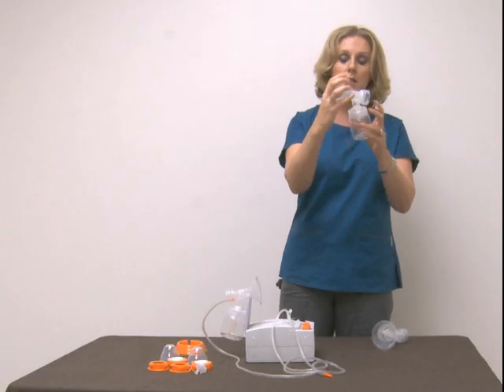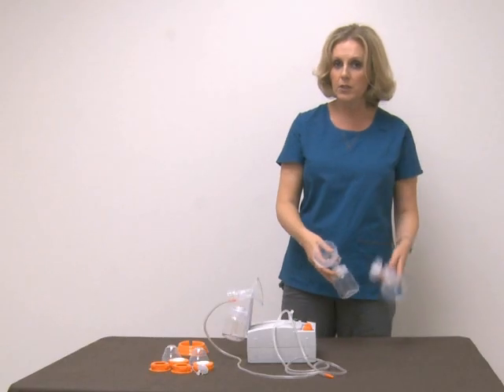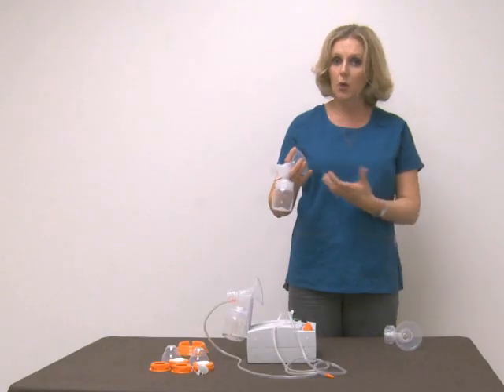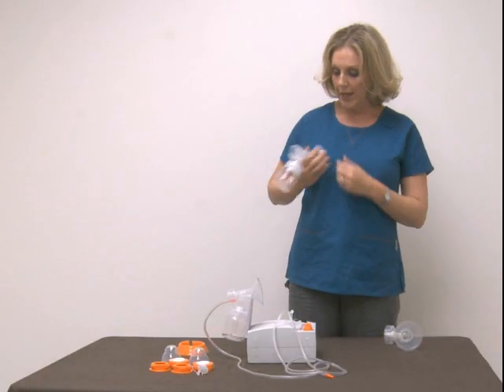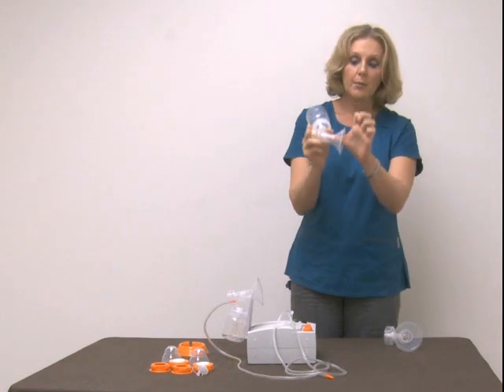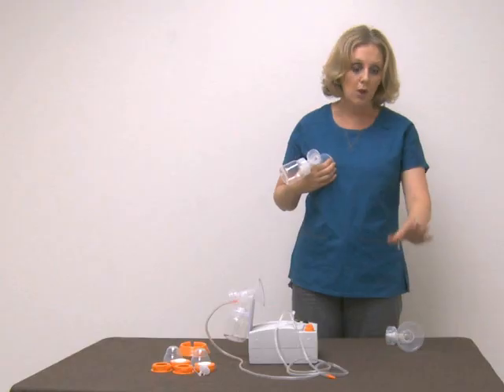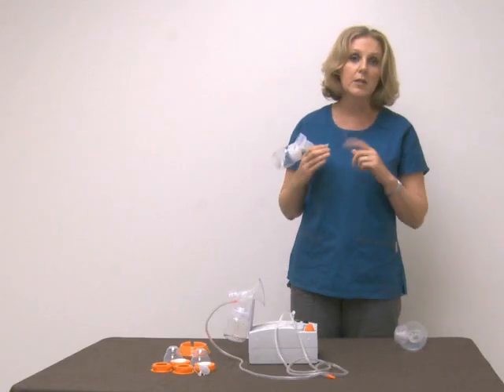This medium size comes standard with all kits. Unless you already know you have a very large nipple — meaning before even turning the pump on, you put this on and your nipple is touching the sides — if you're right up against the side before even turning the pump on, go ahead and get to your local Hygieia dealer or order through the web. You'll want to go up a size because the medium will be too small.